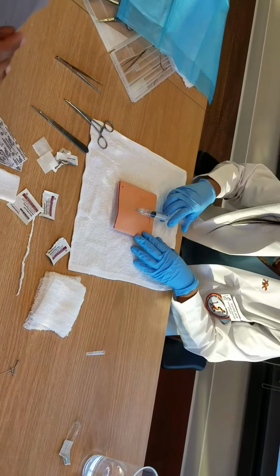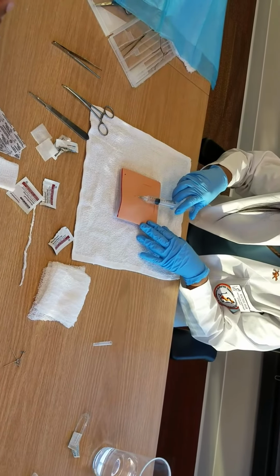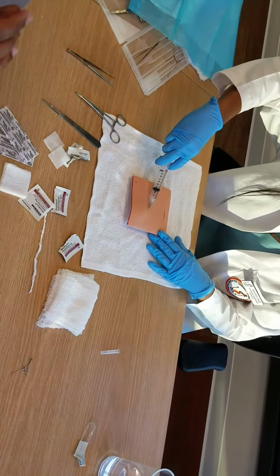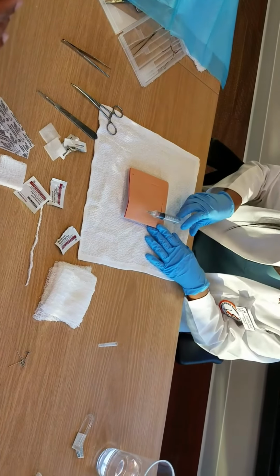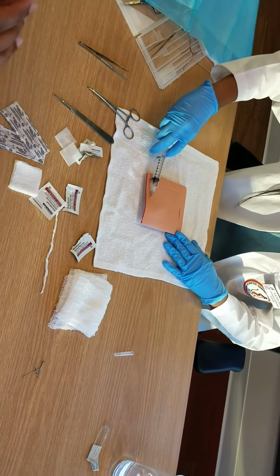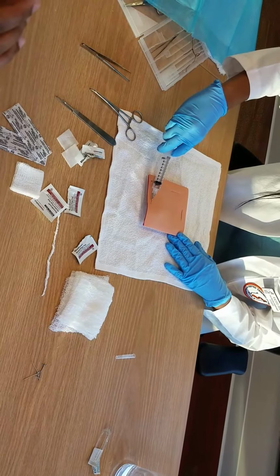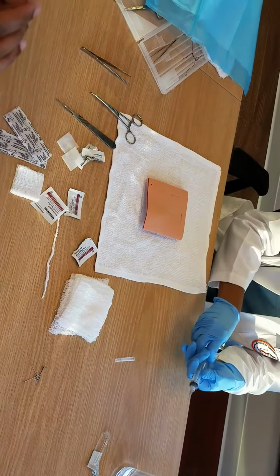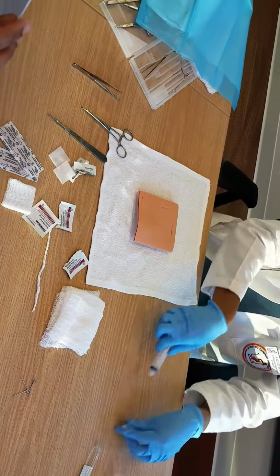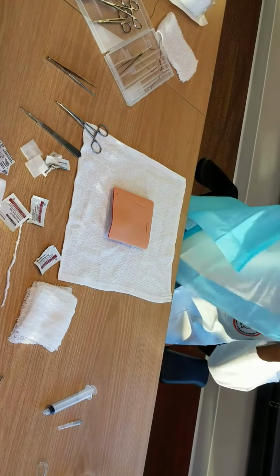Okay, so you want to kind of go around the abscess. I'm inserting in and injecting the lidocaine as I pull out. I have the consent from the patient and they are aware of everything that I'm doing. And the last final side. Alright, and then you want to wait approximately 5 to 10 minutes for the lidocaine to actually take effect. Then we can properly drape the abscess.